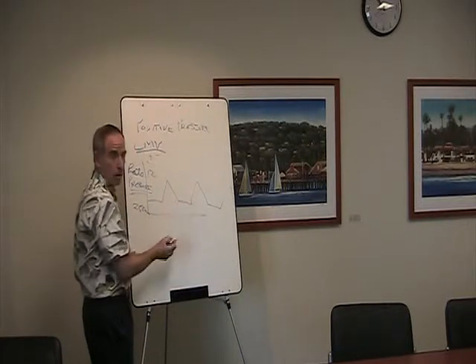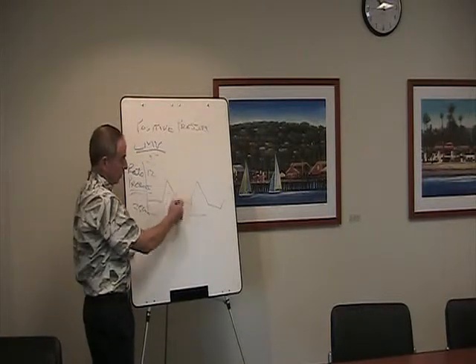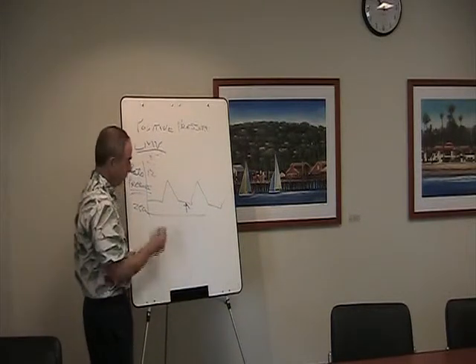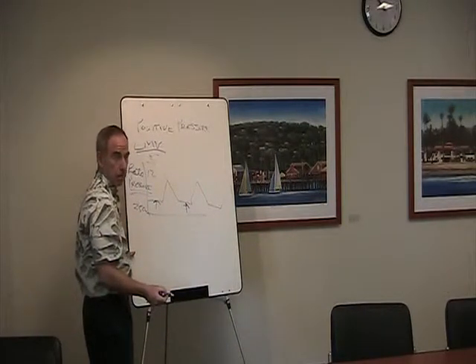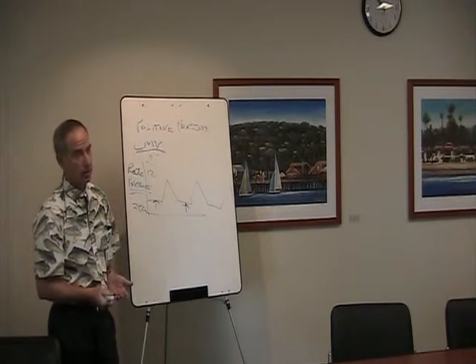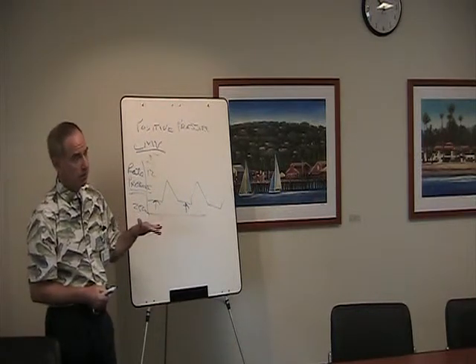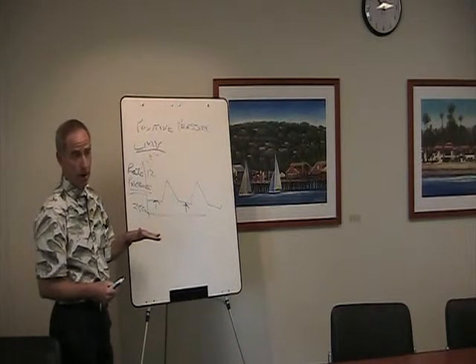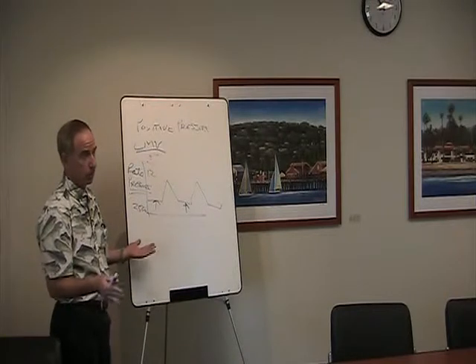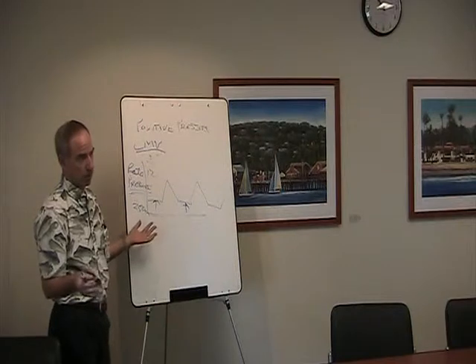So these are the set breaths. If the patient tried to take a breath here, or here, what would happen? Nothing. They would get nothing. There's a closed valve. So in this mode of ventilation, if the patient tried to take a breath, they would get no air. Now, that kind of ventilation works fine in the operating room when you have the patient under general anesthesia who's not breathing, or may even be paralyzed.